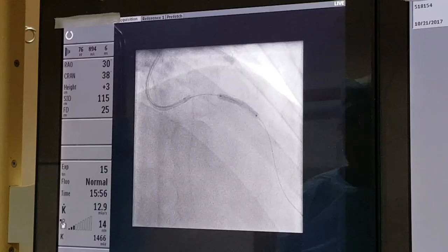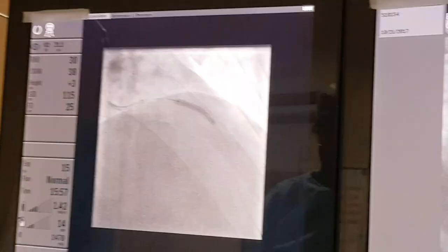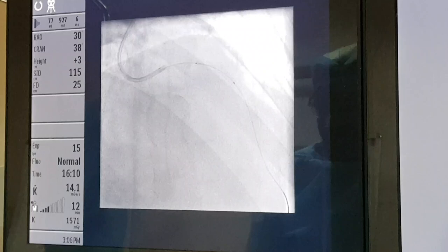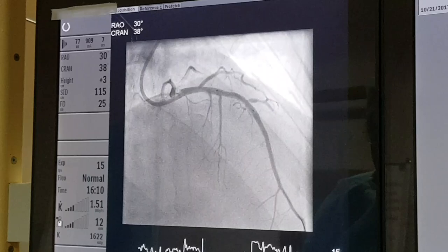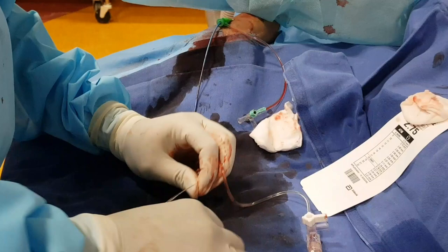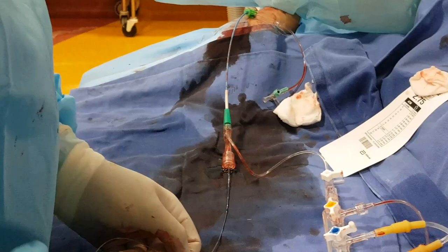Now I am deflating the balloon. The stent is deployed. I am going to see the result of the stenting — the stent looks fine, it looks well deployed. The stent was mounted on the balloon; now I am just removing the balloon away from the stent and from the guiding catheter. That is the balloon on which the stent was mounted — now only the balloon comes out and the stent has been deployed.